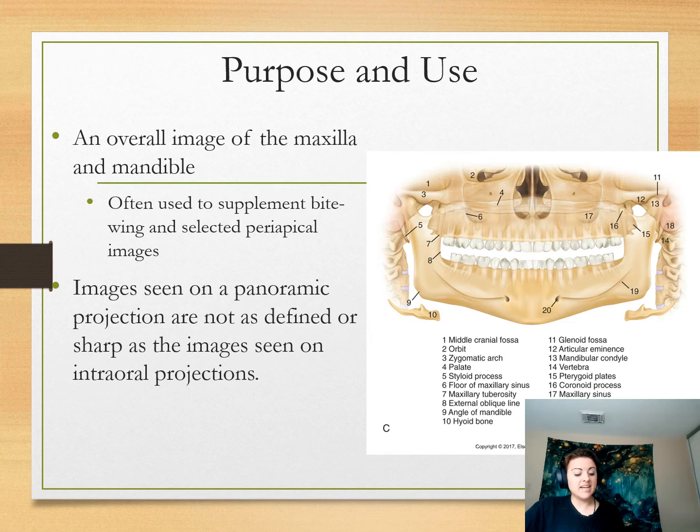We need to be able to detect diseases, lesions, and conditions of the jaw. So sometimes, especially around unerupted or impacted teeth, we see lesions grow. We see some type of abnormality. There are cysts or tumors that grow inside the bone that we wouldn't necessarily capture in their entirety with an intraoral image. So we need a pano. To examine the extent of large lesions.